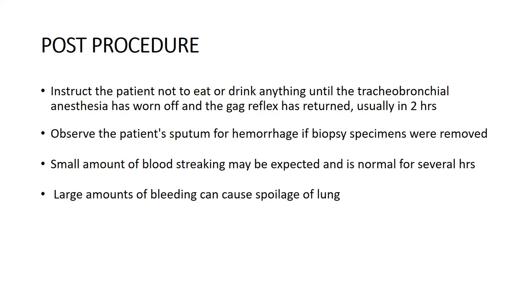After performing the procedure, the patient should be instructed not to take anything for 2 hours, until tracheobronchial anesthesia has worn off and the gag reflex has returned. If biopsy specimens are removed, the patient should be observed for any hemorrhage in the sputum. A small amount of blood streaking may be expected and is normal for several hours. A large amount of bleeding can cause spoilage of the lung and may cause contamination of the opposite lung also.